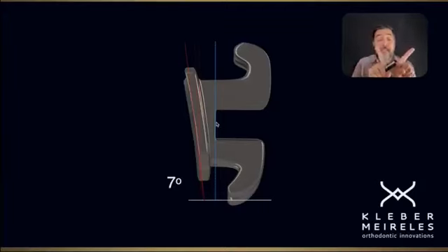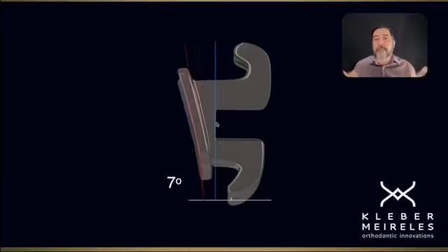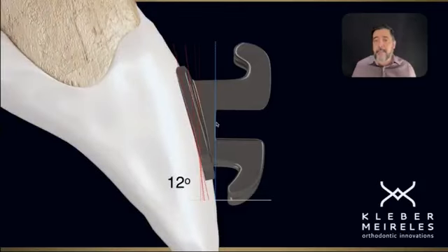And we have the inclination in relation to the base. And if we want more inclination, the base is going to have further inclination in relation to this wall. So this is the prescription. Easy like that. The prescription in relation to inclination, of course, not angulation. The third key of Andrews is here. And it is good, of course it is, because it saves time.